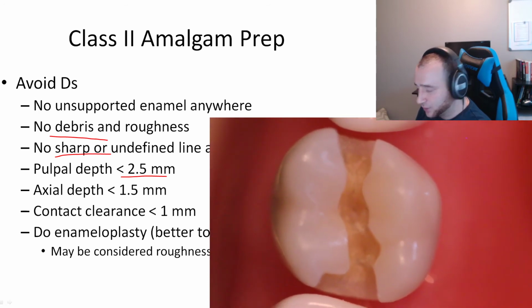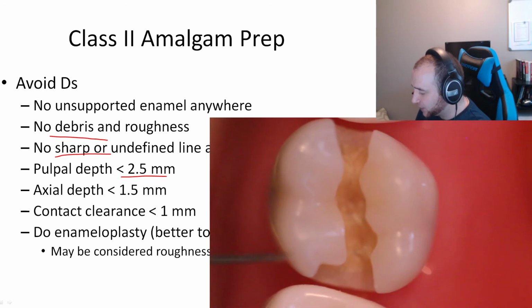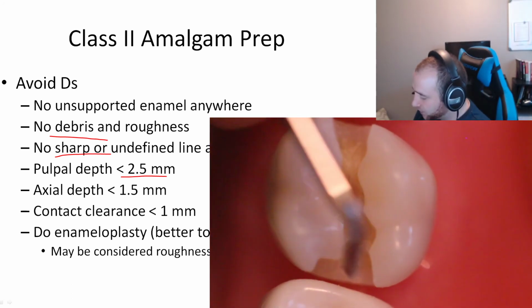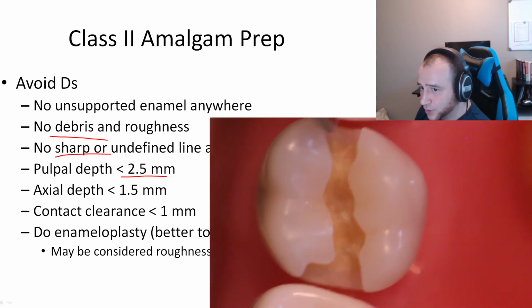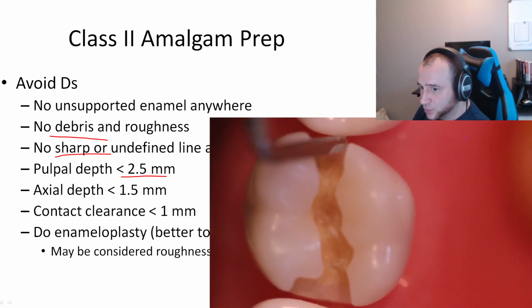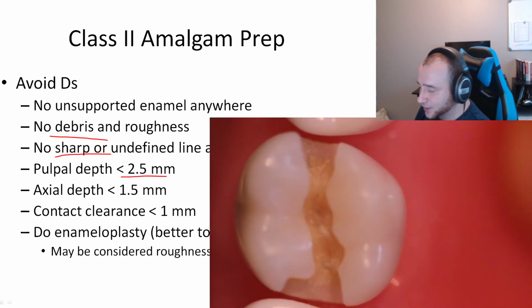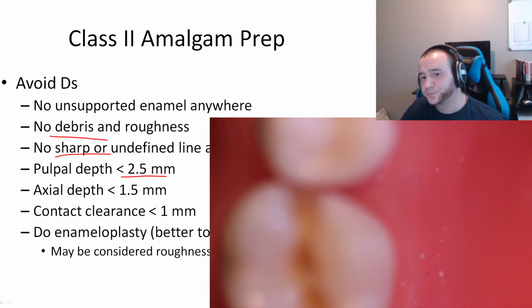Let me see if I get that there. Okay. So once it's cleared, that means I'm good. I got an A. I'm done. Wait, one more thing to do before I get an A. Just make sure this doesn't fit. The 1 millimeter hatchet. Make sure this doesn't fit and doesn't pass through these walls, okay? So you see it's 1 millimeter. I'm trying to fit it in its 1 millimeter width, and it's not. That's good. That means that's an A when it comes to that criteria.